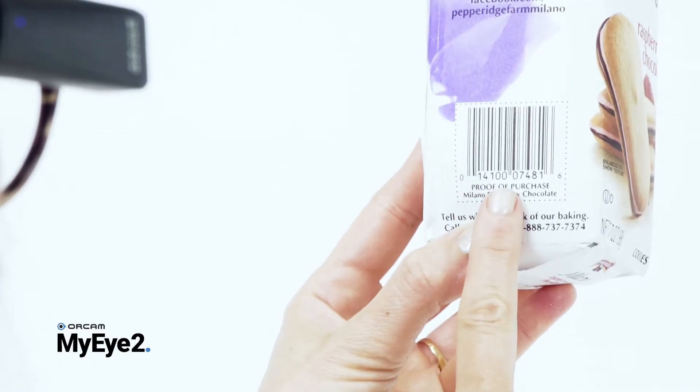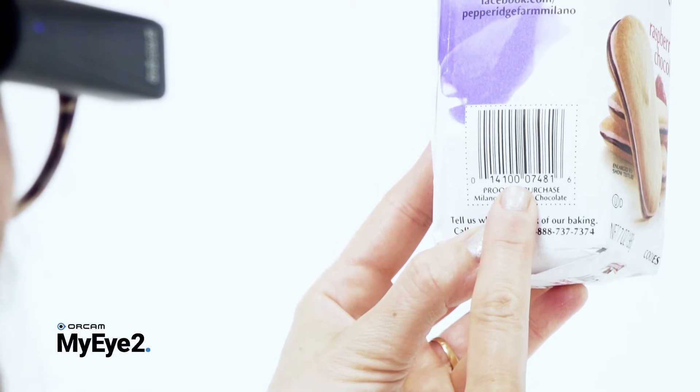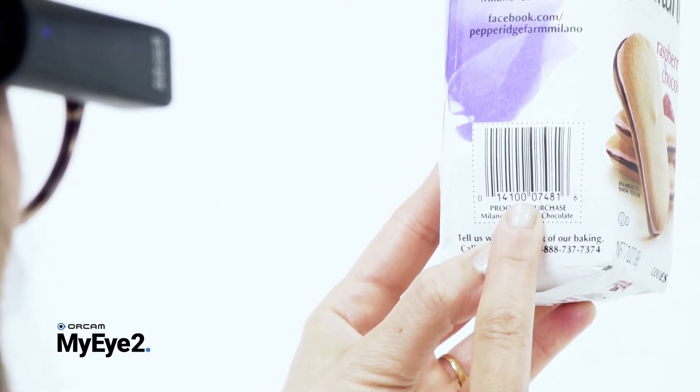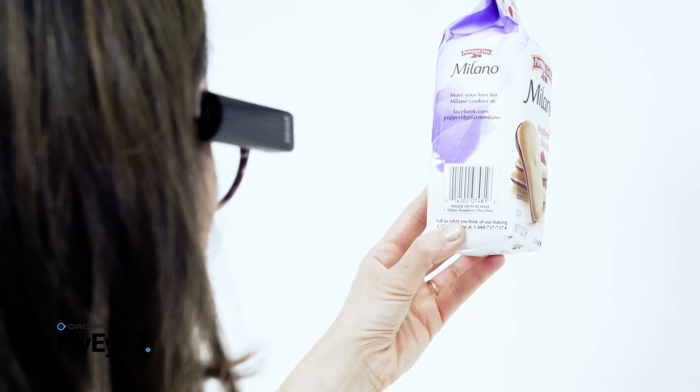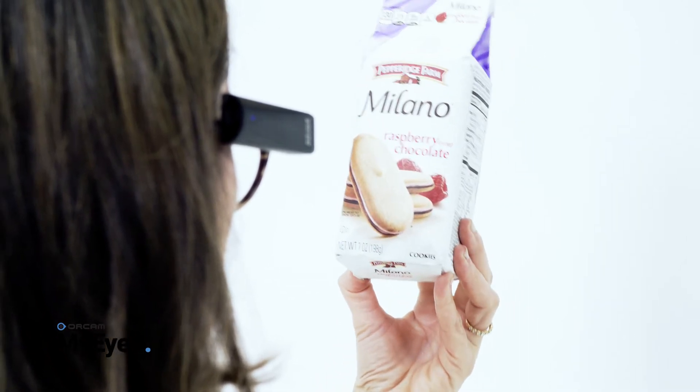Point with your index finger towards the center of the barcode on the product. Avoid obscuring the barcode. When your finger has been detected, you will hear a double beep. Now move your hand away. You will hear the camera shutter sound followed by an announcement of the product's details.